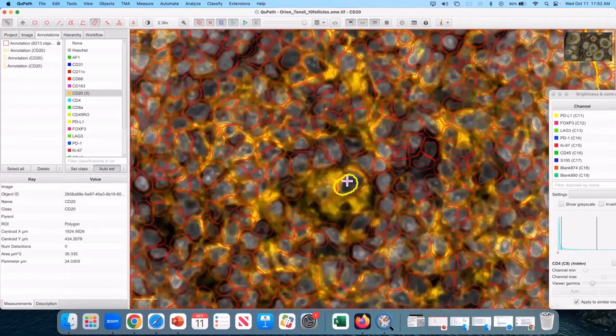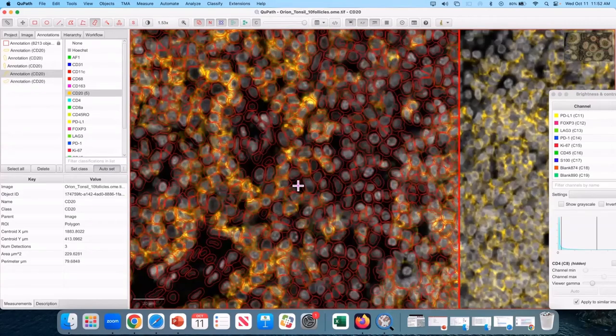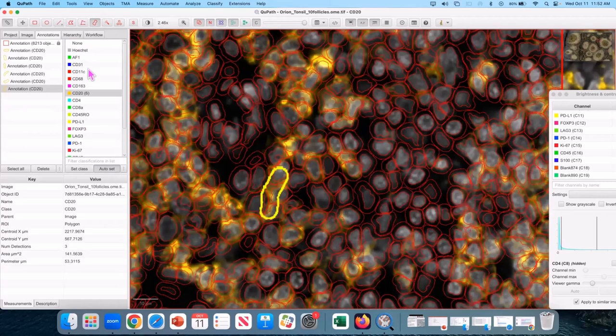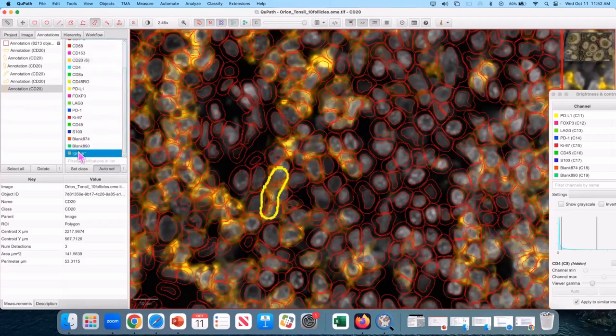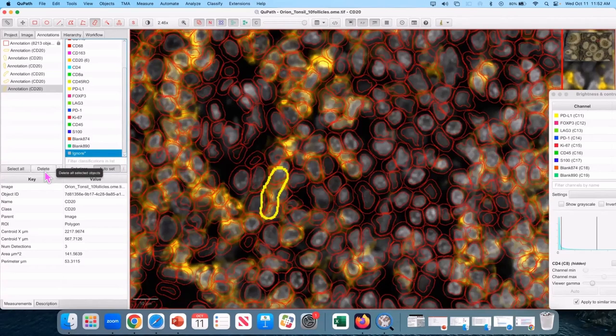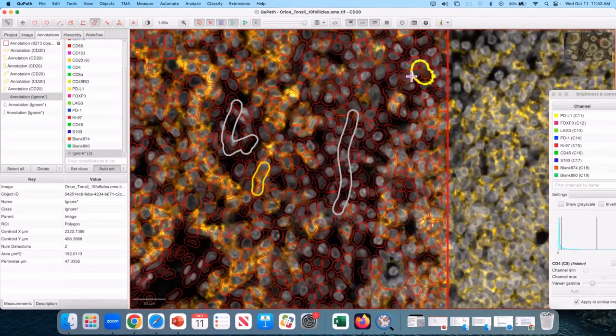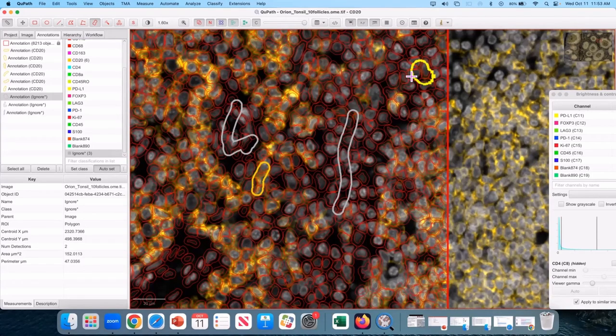Right now, I'm only going to spend like a minute or two for a classifier because the point of this exercise isn't accuracy. But obviously for your actual project, you want to spend more than that. And this part's important. Make your positive cells CD20 and your negative cells the ignore class. Don't make them other or negative or anything like that. They have to be the ignore star. The main benefit, particularly for multiplex classifiers, is anything that is classified as ignore, it's just not going to write it down. So you'll have some cells that are CD20 and then some cells that are blank. And then when we then also add on the CD4s, you'll have some cells that are CD4, but it's not going to say CD4 or CD20 negative. It's just going to say CD4. And as you add more and more, you just want fewer words.